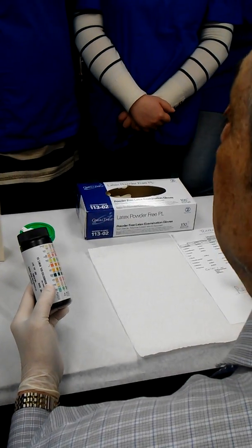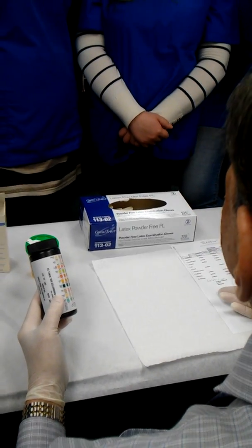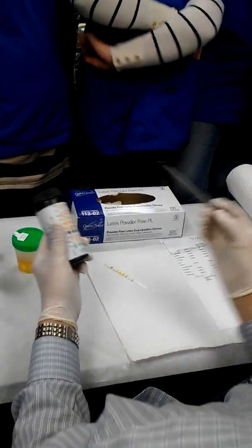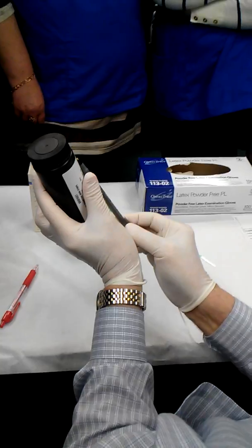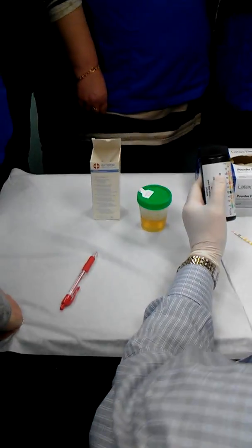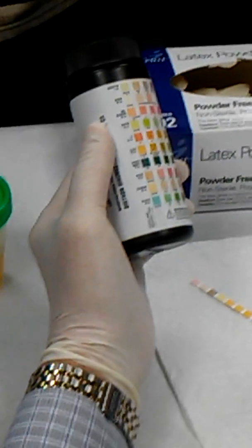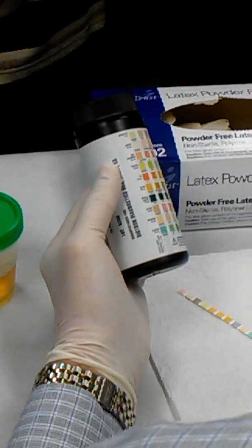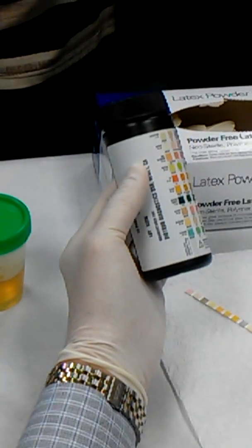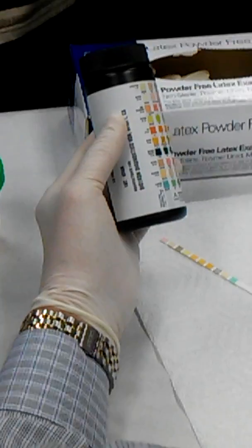So if you see other colors, it means you found something in the urine, right? What can you find in the urine? 10 substances. It's written on this page, right? So what are these substances? First of all, leukocytes. You see here leukocytes. It could be positive or negative, right? If it's negative, it's okay. You didn't find leukocytes. If it's positive, it's not good. It means you found leukocytes in the urine. It should not be in the urine.